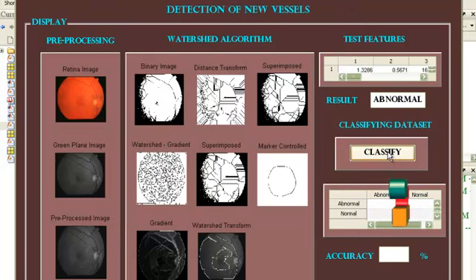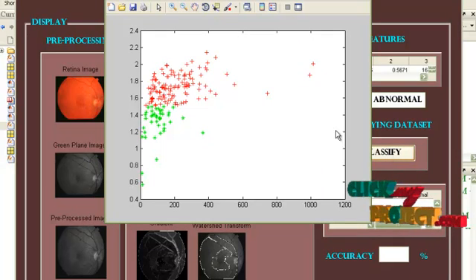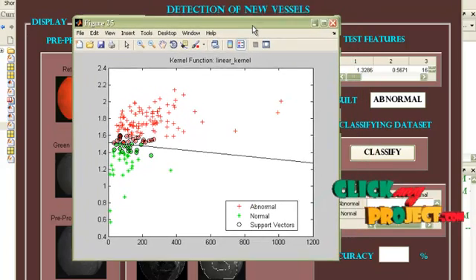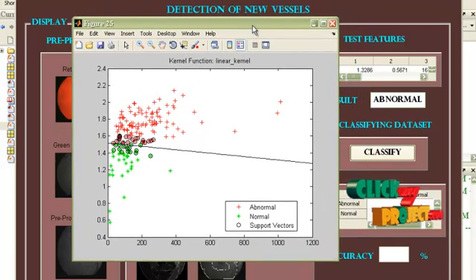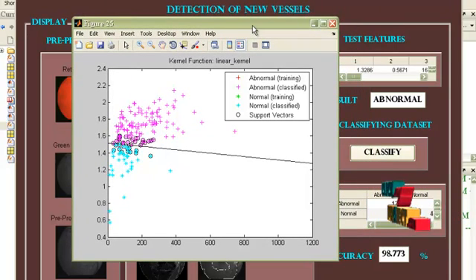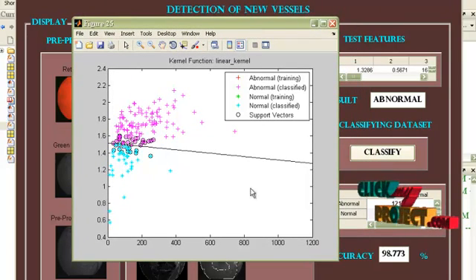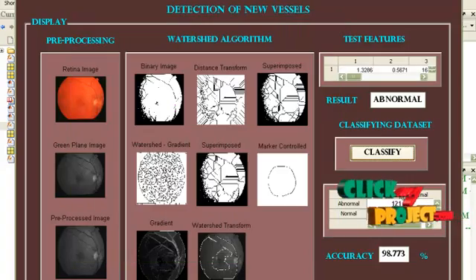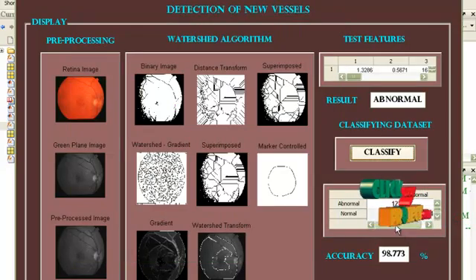Now classify the entire data set. This is the classification done for the entire data set, normal and abnormal. And this is the graph representing it. And you can see a confusion matrix displayed here.